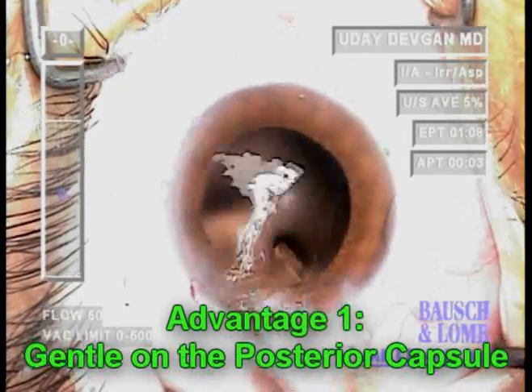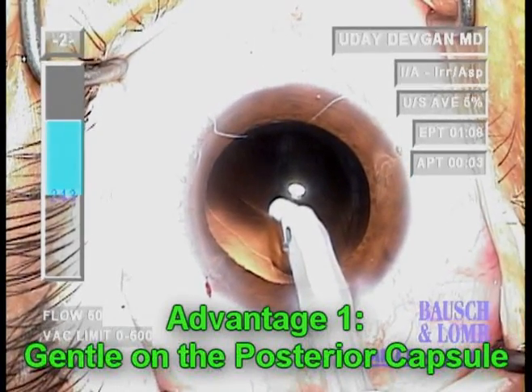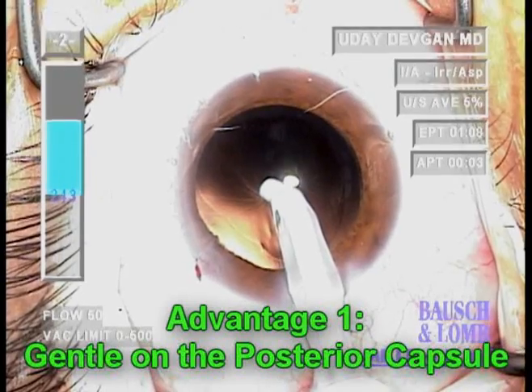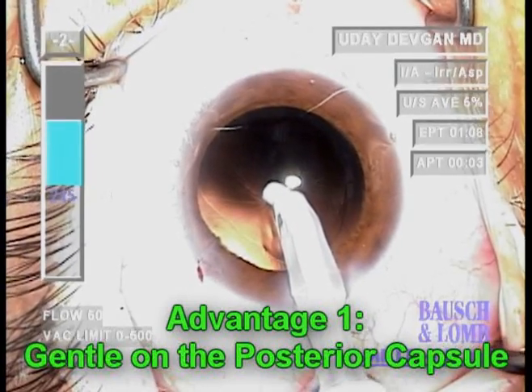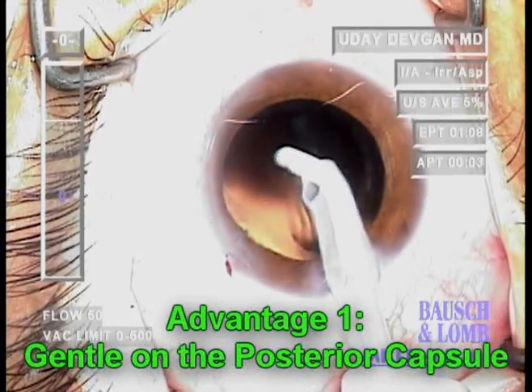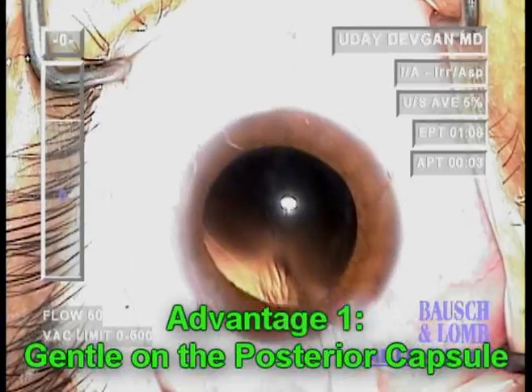Here we see, again in slow motion, direct occlusion with the posterior capsule. We see the spider-like striae. We apply the vacuum, yet no metal contacts the posterior capsule, and the capsule stays completely intact. This is far more gentle on the posterior capsule than the traditional IA tips.